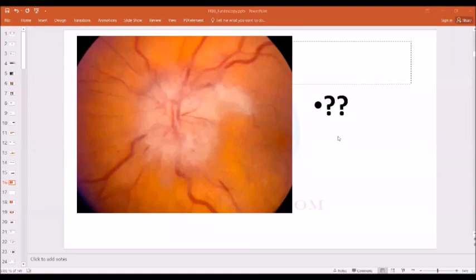What about the optic disc? Papilledema, sir. Is a blurred margin there? There are some. Anyway, this is a white optic disc, no doubt. In general, a white optic disc. Okay. Can anybody say anything more here? Could it be primary optic atrophy or secondary one? If it is white, we mean that optic atrophy. Dr. Uddin? Yes, sir. Possible.